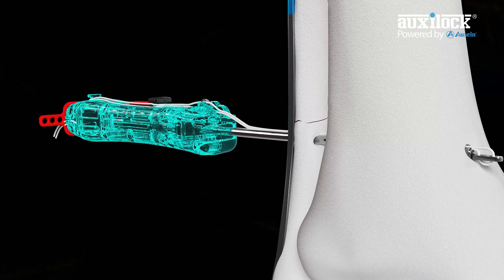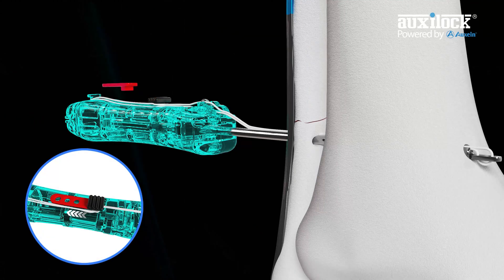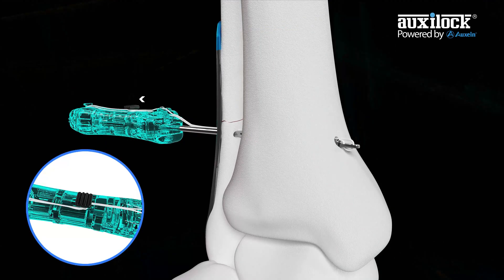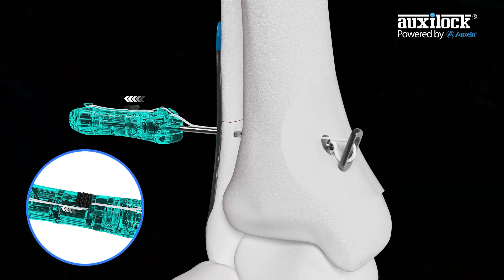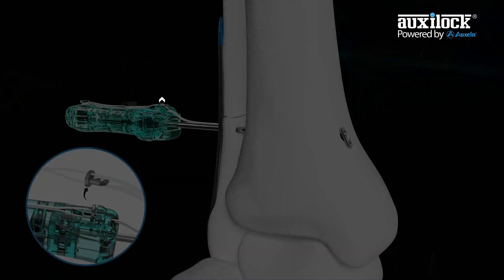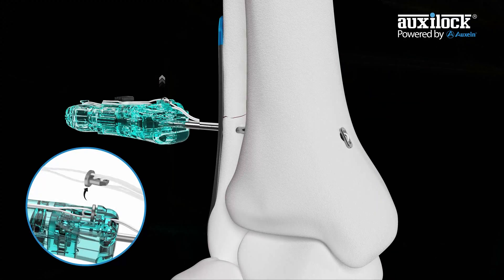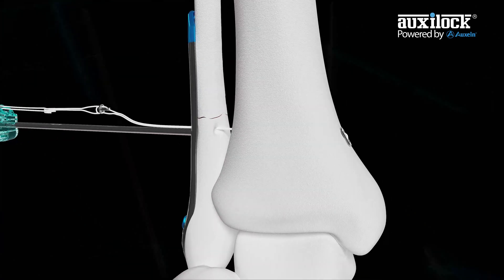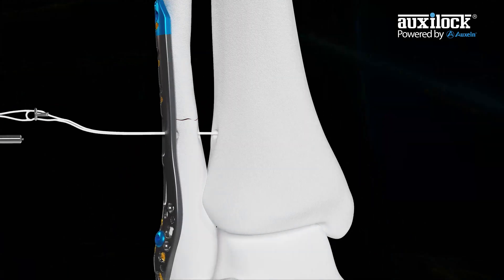Remove the red safety tab. Deploy the ultimate button on the Advanced Syndesmosis Ultimate Kit by engaging the black button away from the handle construct. After deploying the ultimate button, push the Advanced Syndesmosis Ultimate Kit medially. Visualize a T-shape on fluoroscopy.